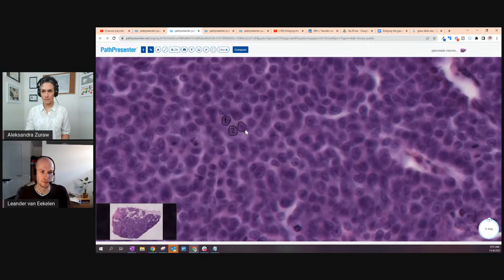This is very nice because if you have an application in which you are interested in the actual shape of discrete or individual cells, then you might choose instance segmentation, and it's a sensible way to go. There is some trade-off, and now I think we're getting into some more nuanced deep learning stuff. There are trade-offs between choosing these types of model tasks. I don't know if we want to get into those right now.